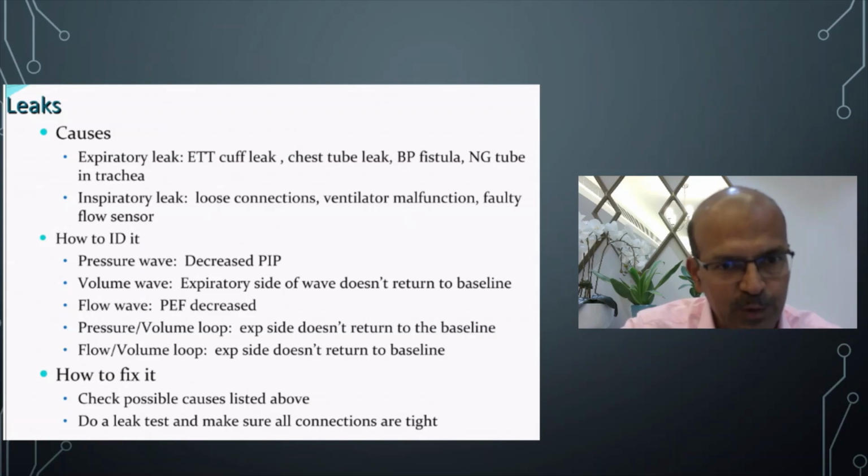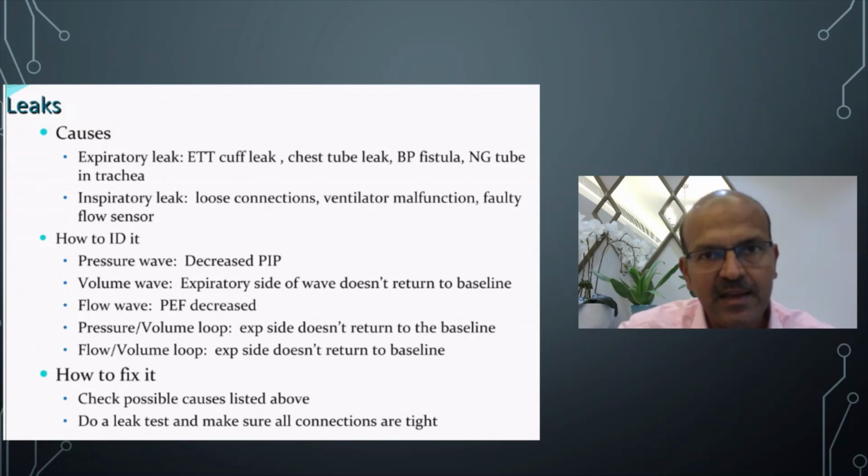So if you know your ventilation basics, I mean, for many of us who trained in the era before we used volume guarantee, we are comfortable using synchronized modes like SIMV or SIPPV or assist control. So we are happy to switch, but the newer trainees, because they are used to volume guarantee, are hesitating to switch. Remember that if you use it sensibly, if the pressure limits you use are sensible, you are weaning quickly, that's the key. You are watching the baby, you are watching the settings, you are weaning quickly, then both modes shouldn't be much different.